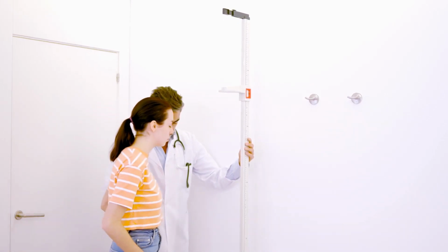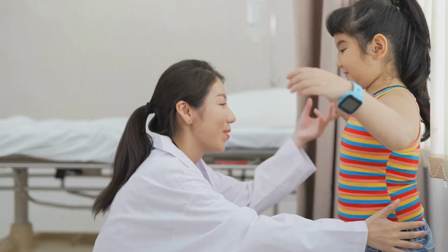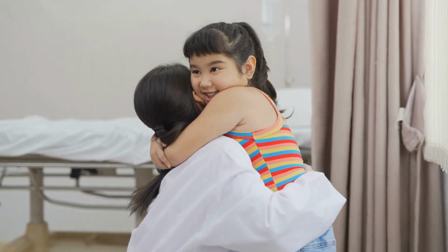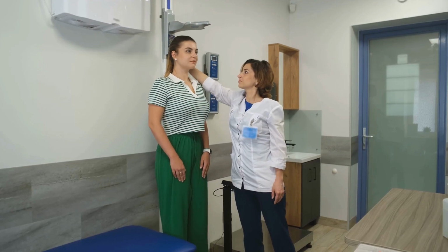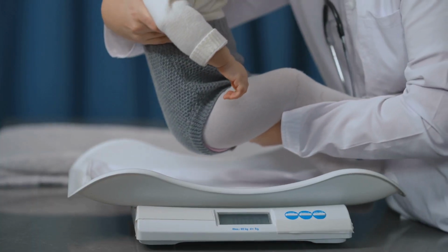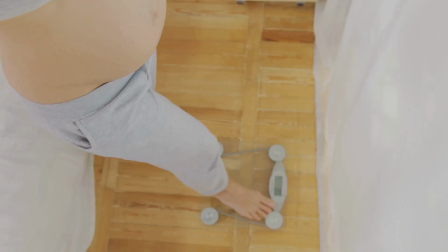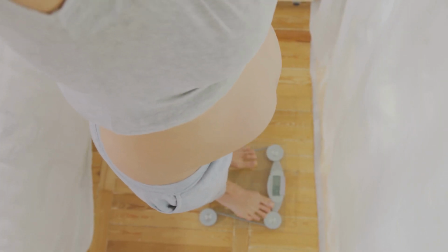Height, weight, and pain. Completing the picture. Measuring height and weight is crucial for assessing growth, development, and overall health. Height is measured using a stadiometer, and weight is measured using a scale. Ensure accurate readings by calibrating the equipment and having the patient stand straight with shoes removed.